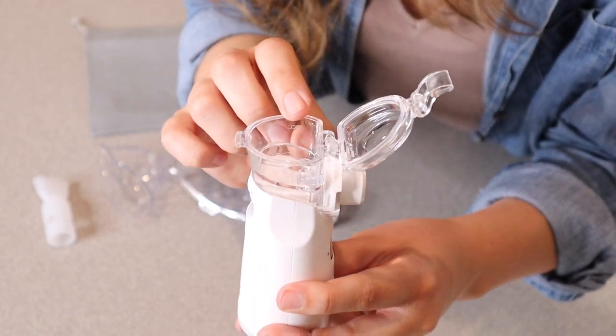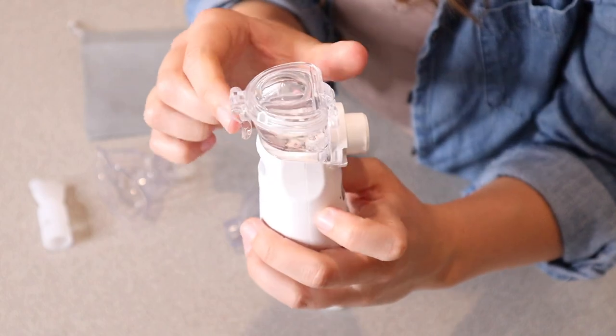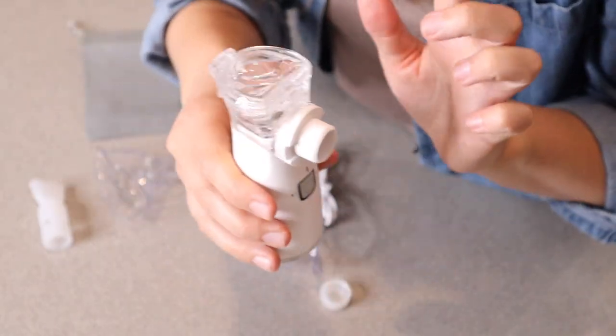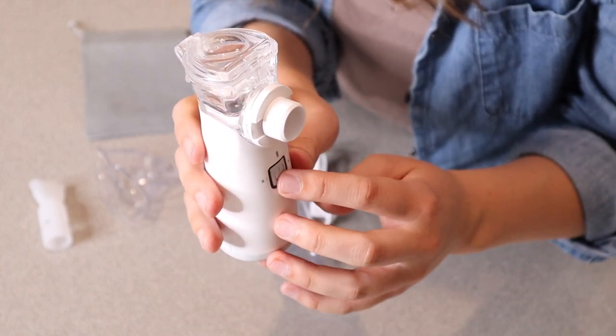I'm going to go ahead and just put some filtered water in here just to show how it works. You can see I have this filled up with water. You're just going to clasp this shut, and once it's clasped shut like that, this is not going to leak out any water, medicine, or anything that you have in this little container.